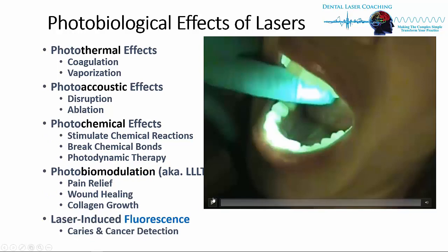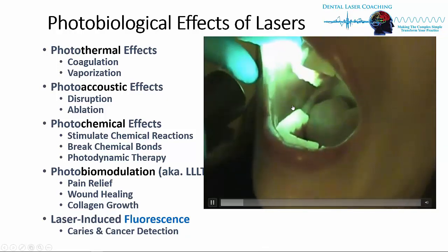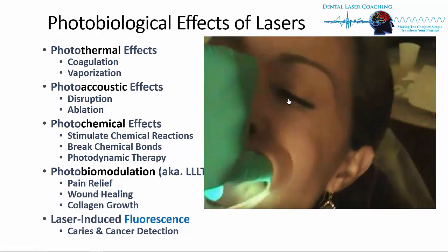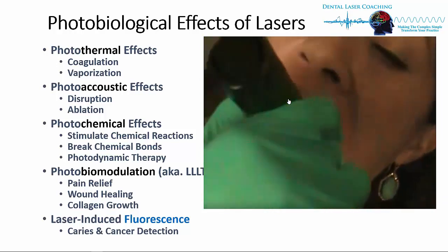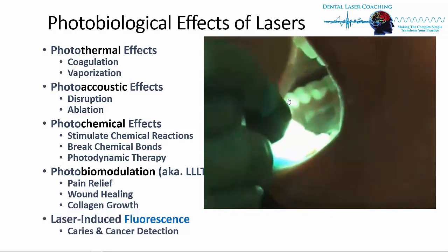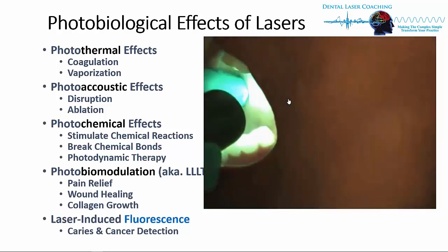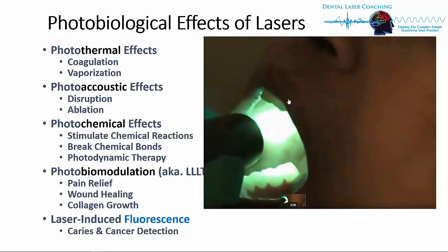And the last thing here is fluorescence. You're probably familiar with this for caries detection, but also cancer detection. I want to take a minute here. You can see here basically what we do with specific fluorescence when you go into the mouth. If it's cancerous, it shows up as dark instead of clear. It could be a scar. It could be a couple different things. There are false positives, but it gives us a chance. It gives us things to look for, things to send to the lab. And I implore you, please, companies like OralID and others have been doing a great job. Oral cancer is the only cancer out there that is trending up. Every other cancer is going down in our society, and it has to do with detection. We need to step up in the dental community and help with detection, and this is a great technology to do that.